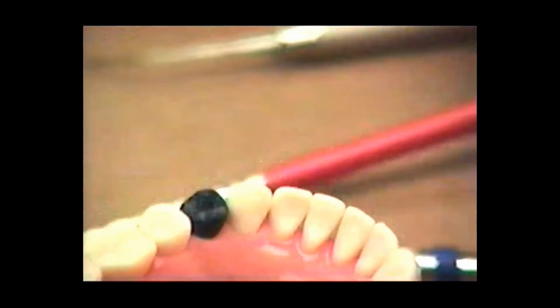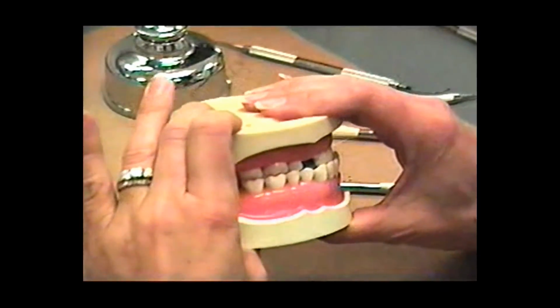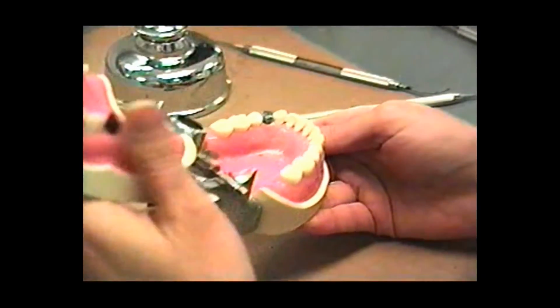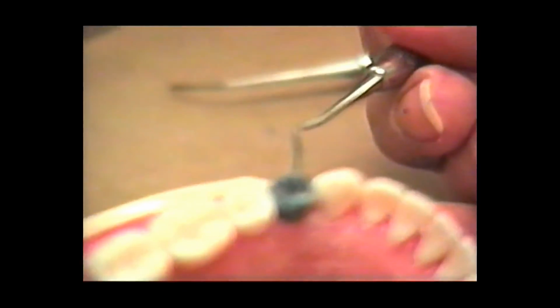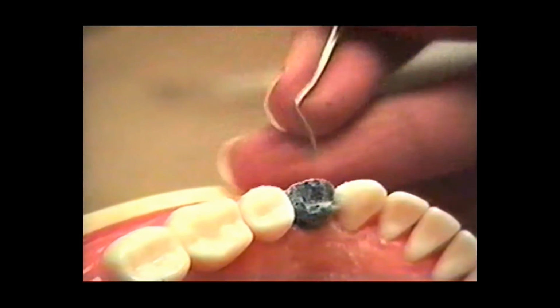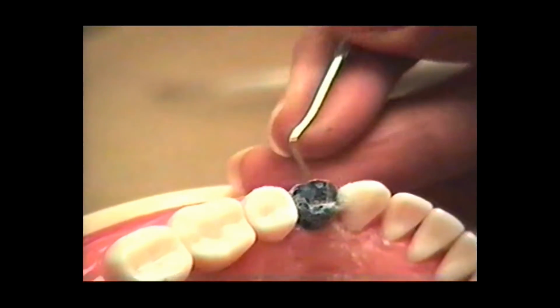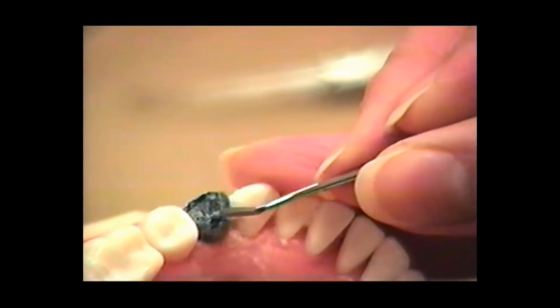Okay, we're just about there, guys. And squeeze again. We've got one other thing to check. Okay, we are right about where we need to be. You'll see there's a contact here, it's heavy still, right here. There's a contact here, still one on the distal cusp arm. Let's just take this down one more time. I promise I'm going to be done in about 20 seconds. Take this one down. Recheck.